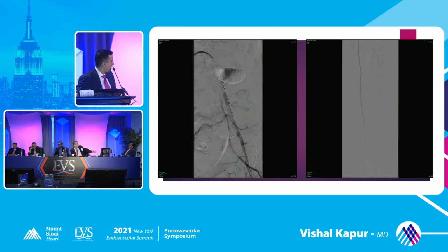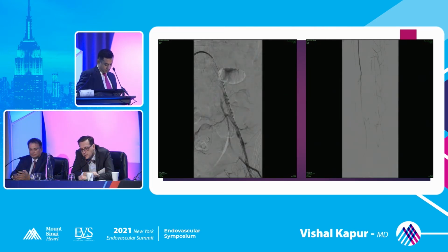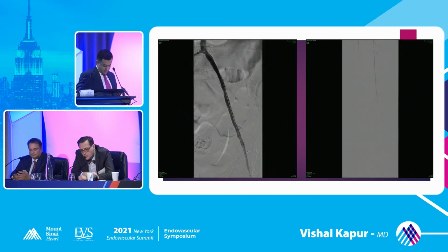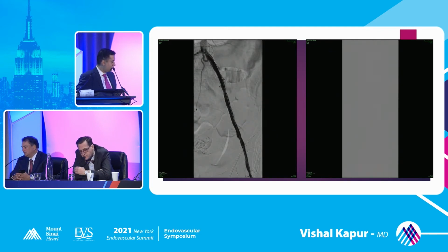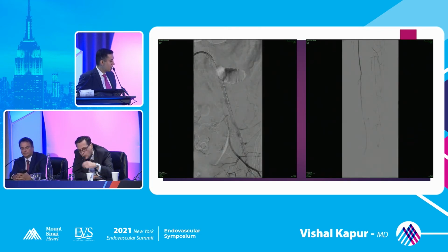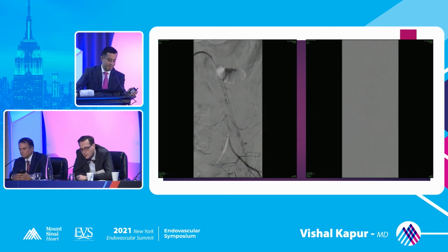Just want to notice that the sheath could have been like 10 millimeters down, so it's a little bit more aligned with the vessel. That might have helped a little bit. You know that the right femoral sheath, while placing it, could have been a little bit more aligned. Right now, it's basically coaxial, it throws you through right next, and probably that's where you stripped it. The stripping started and then kind of continued slowly.